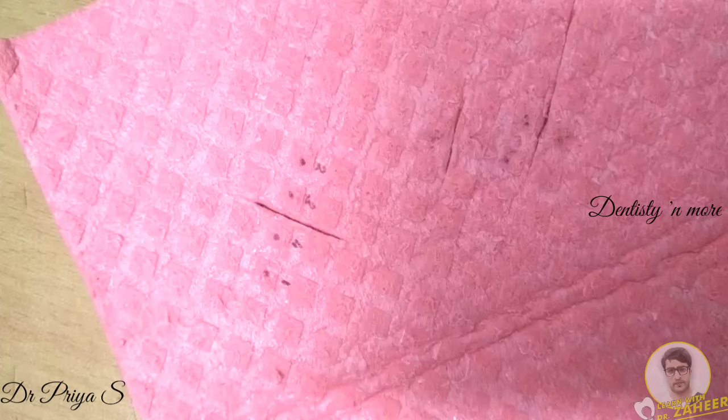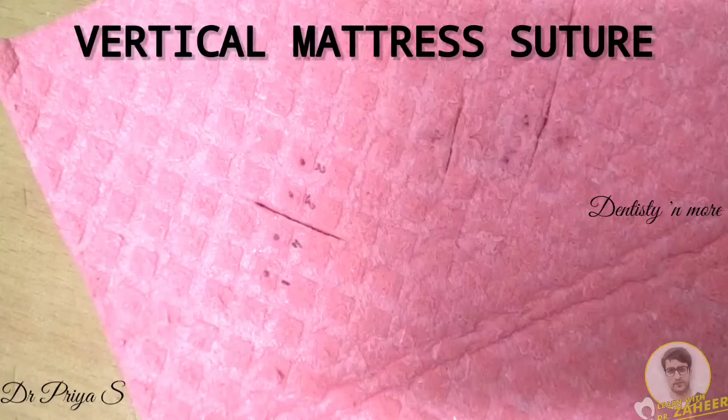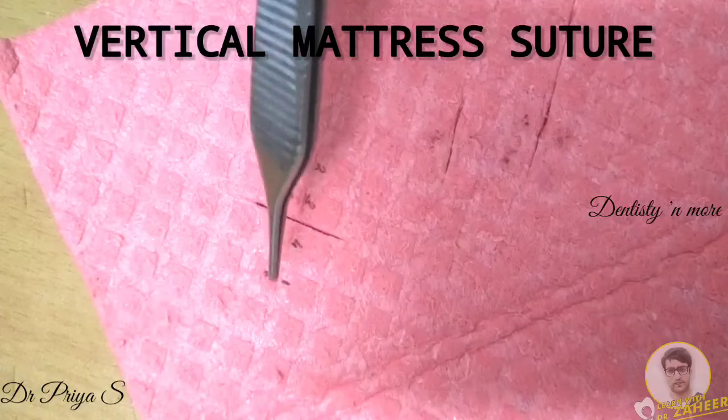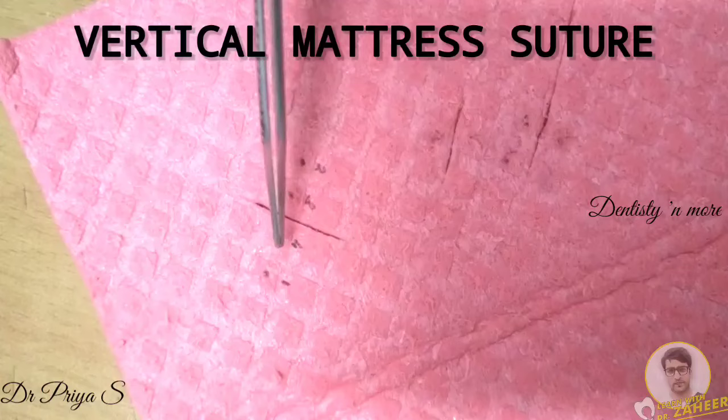The next suture technique is vertical mattress suture. It is similar to a simple suture but an additional bite is taken through the wound edge for edge eversion. The first pierce or bite in a vertical mattress is taken deep and slightly more away from the wound margin when compared to that of a simple interrupted suture.